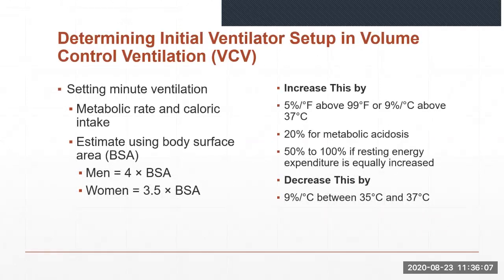We will examine how minute ventilation and other variables are set during the initiation of volume ventilation, then focus on the settings required to initiate positive pressure ventilation.